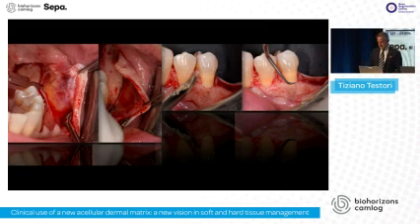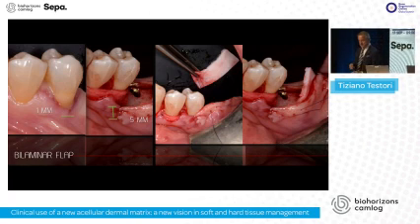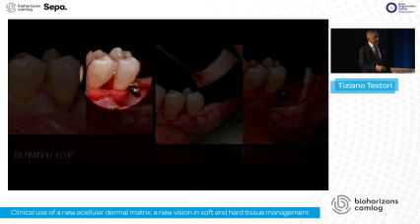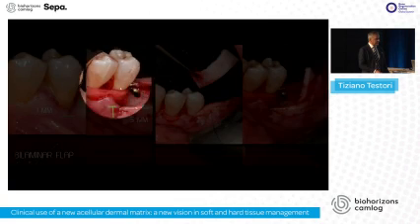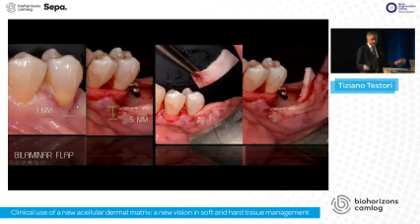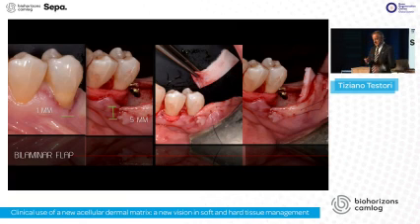Then, according to Zucchelli papers in 2000, we de-epithelialize the surgical papillae, and then a combination of perio surgery and the use of Novo Matrix, as you can see here, used as a connective tissue autogenous graft, a bilaminar flap, to close the two mesial and distal sides at the level of the second premolar in order to increase the height of the soft tissue.